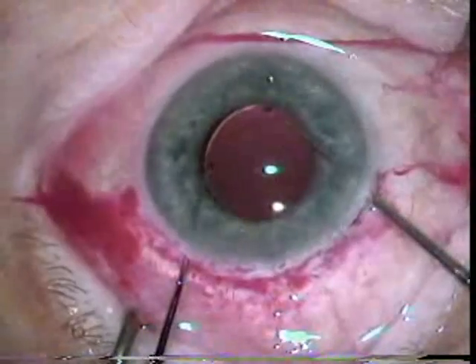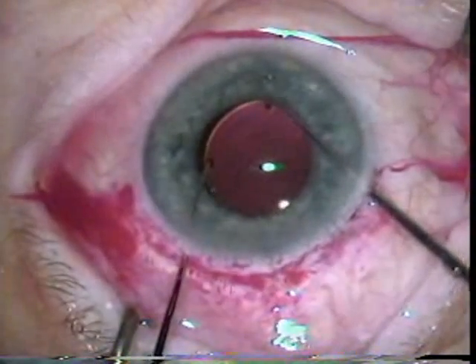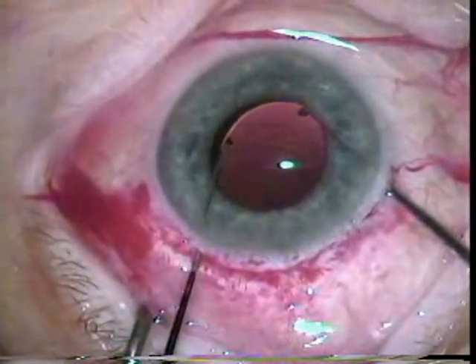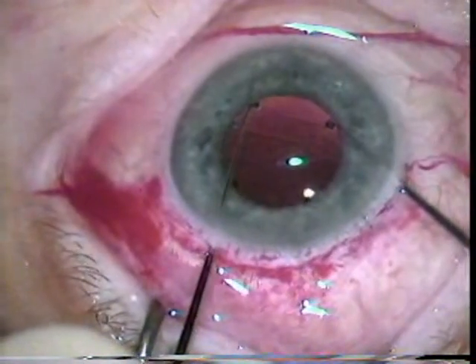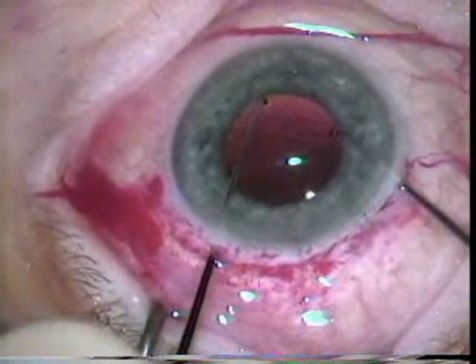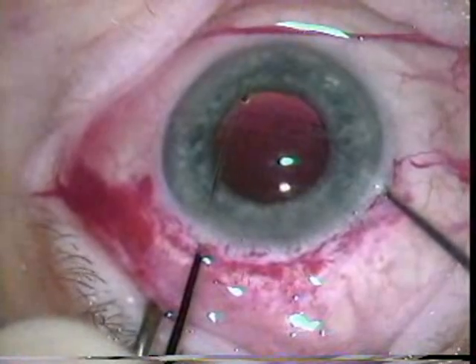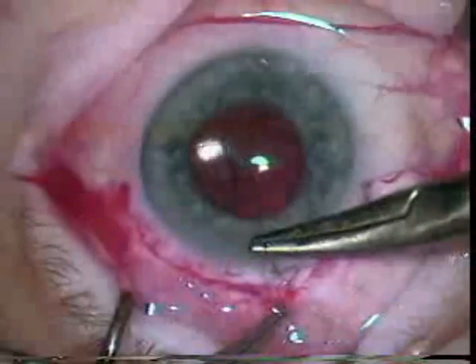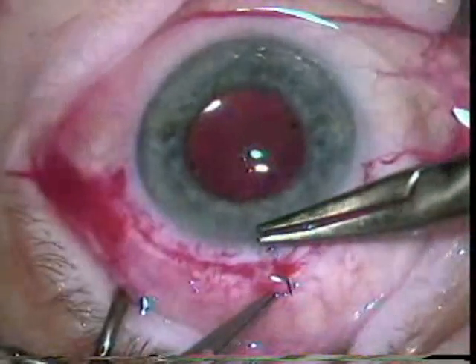Now he's using two hooks, and with the two hooks you can dial this lens. This takes a lot of coordination, but he would dial the lens in an attempt to get the haptics into the bag. One of the things that was hard with the extracap was to get both haptics into the bag because the anterior capsule was not very well defined.